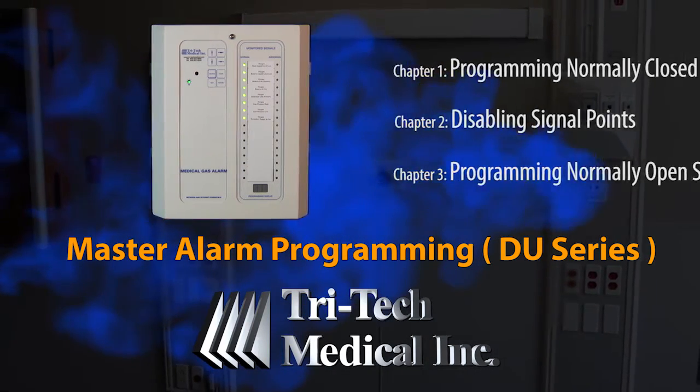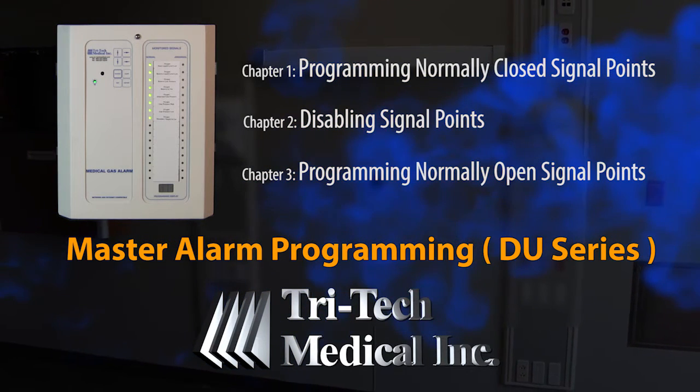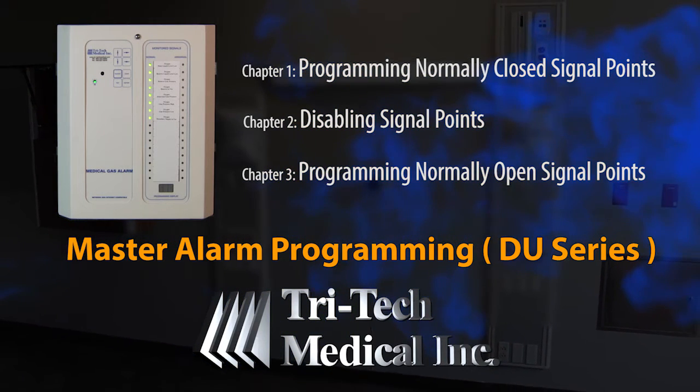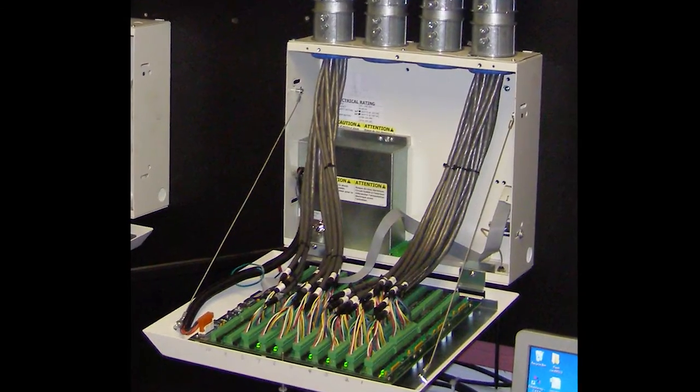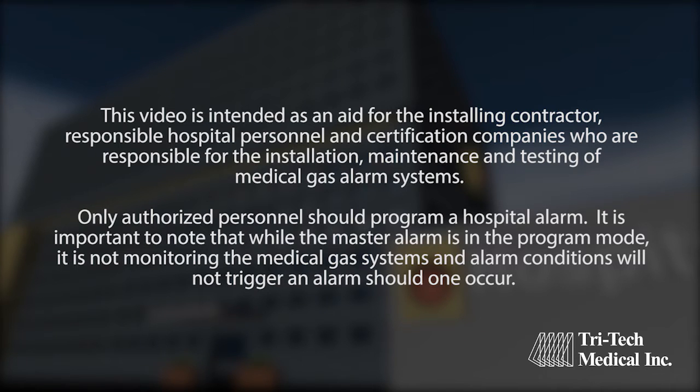This is an instructional video for the Tritec Medical DU or DC series Master Alarm Panel and applies to both the traditional wired and the newer wireless models. This video is intended as an aid for the installing contractor, responsible hospital personnel, and certification companies who are responsible for the installation, maintenance, and testing of medical gas alarm systems.